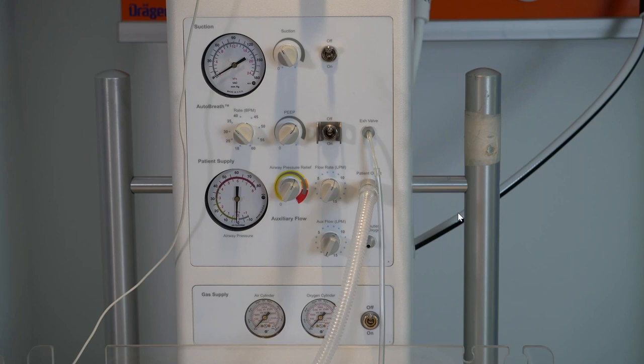CPAP ventilation? So yeah, it's not a hard thing. If for instance you're in a theater and you have the resuscitator, the resuscitator's oxygen, air and electrical cord need to be a bit longer to move it closer to a theater bed or to a delivery bed. That would be number one.